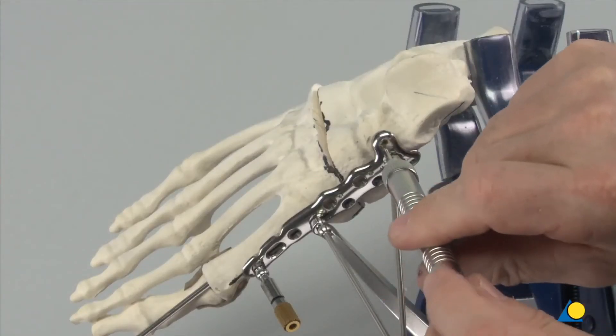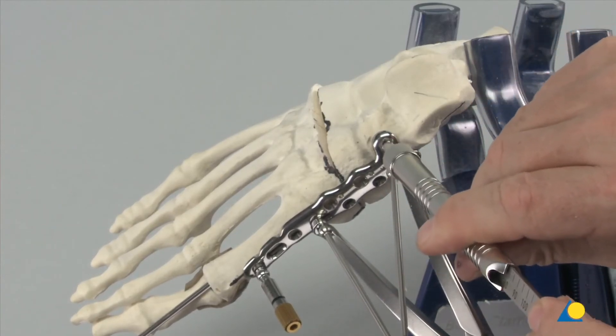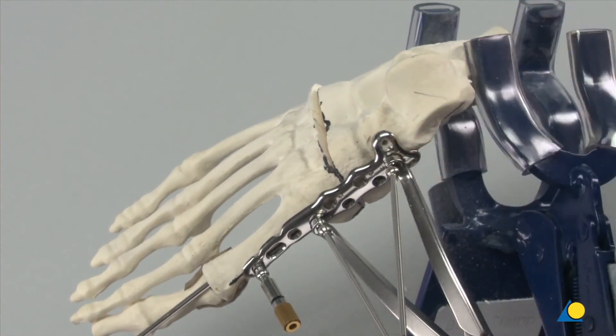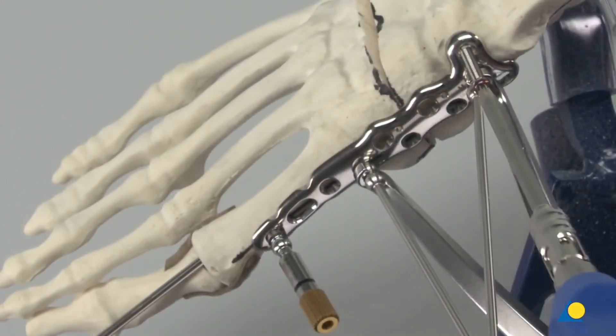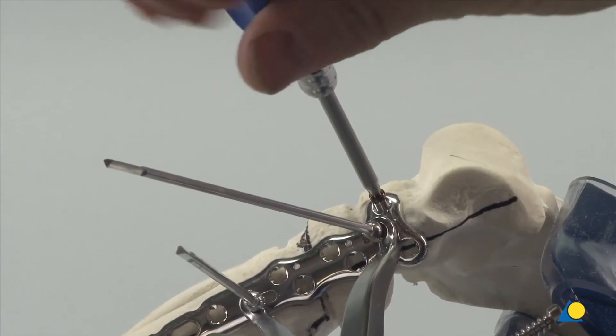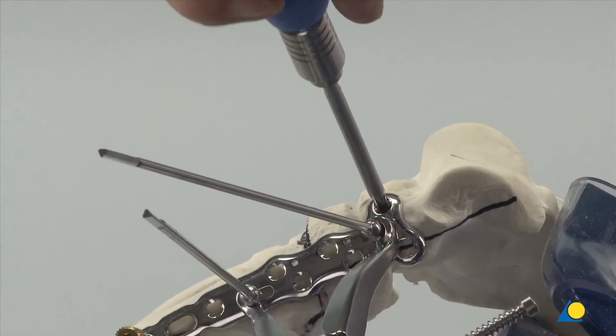The depth gauge is used to measure for the correct screw length. The star drive screwdriver shaft and handle with quick coupling are used to insert the correct length screw. The torque limiter is used for final tightening.